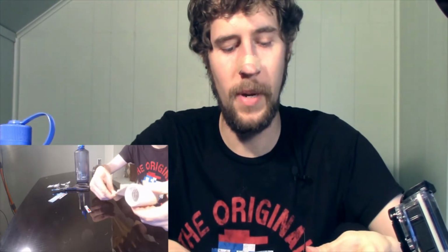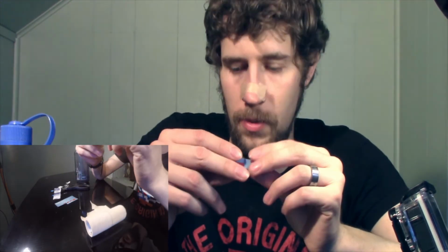So you take your bandage. You can use other kinds of cards too, but they need to be springy, like this, because what it needs to do is lift up the bandage. That's all something like this is: an adhesive and something springy and cardboardy. So that's all you need. I use this because it's really effective, but you can use something a little bit weaker if you don't need it to lift up so much. The problem is that the card is sharp, and if you put it on your nose without covering it first, it's going to hurt.